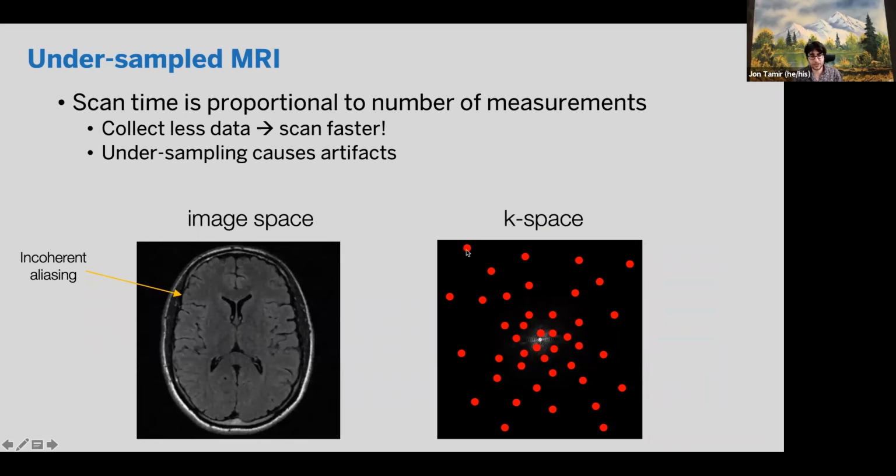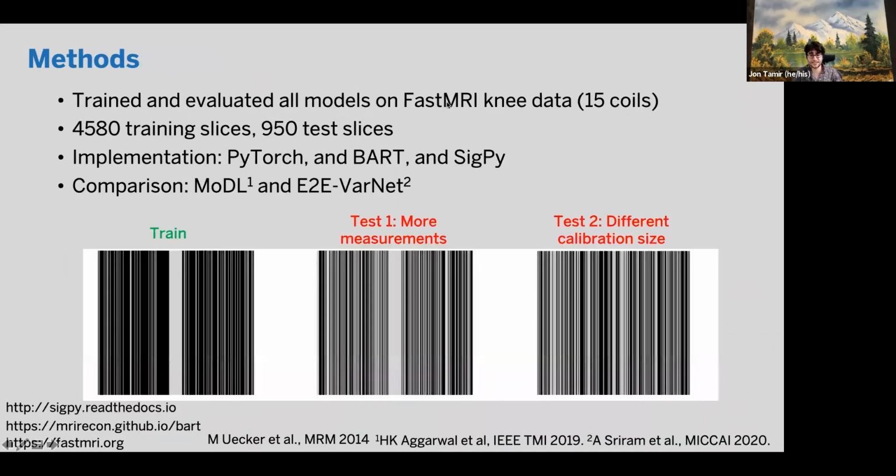But we can also think of it as these are actually lines into the board. And if we looked at it at a different orientation, then these would just be lines that we're sampling. And the reason we're doing that in this case is that the fastMRI dataset is a 2D acquisition. And so the sampling pattern that we get is fully sampled vertical lines, and we can choose to skip however many of these vertical lines as we want.